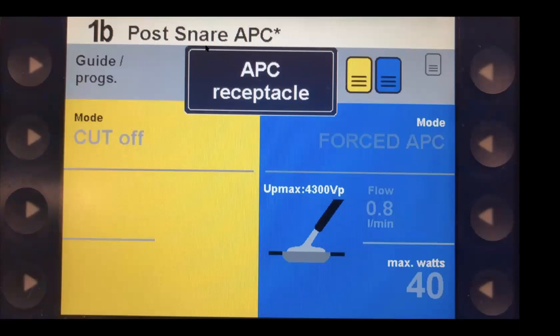Okay. One thing to keep in mind is if you look at electrosurgery units in terms of how much voltage is delivered, for a soft coagulation, you are delivering less than 200 volts. But keep in mind that soft coagulation does seal the blood vessels.